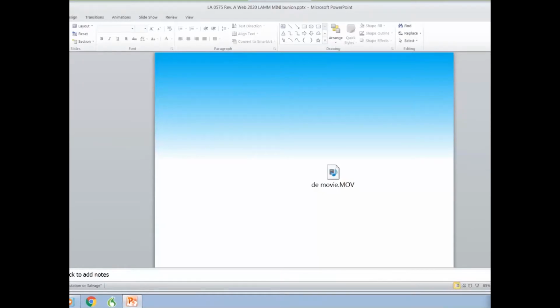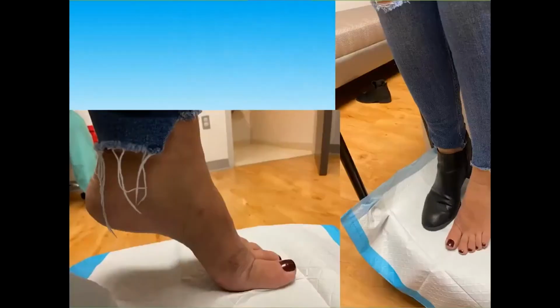And so here's a patient 2.5 months post-operatively. You can see she's well healed, not much of an incision, so she's real pleased. She's back to her little wedge-heeled pretty shoes or boots, and she's extremely happy.